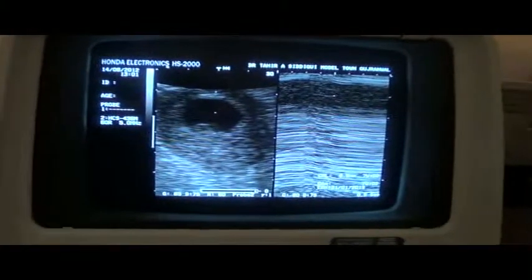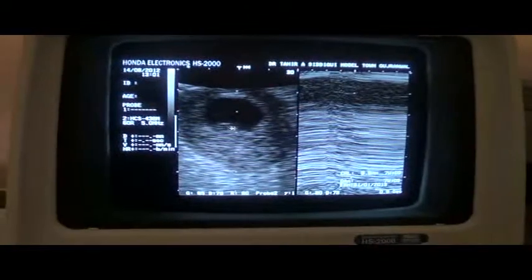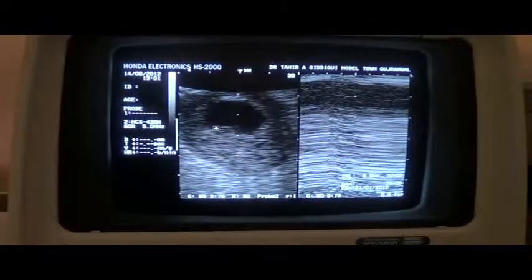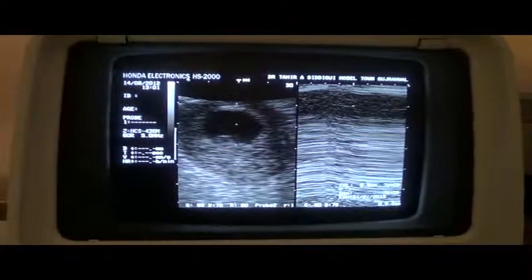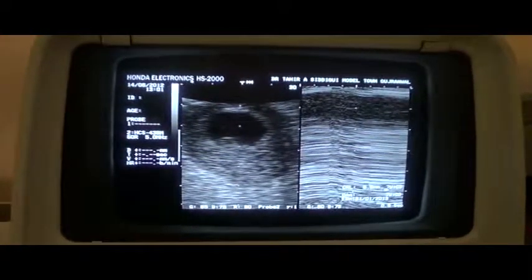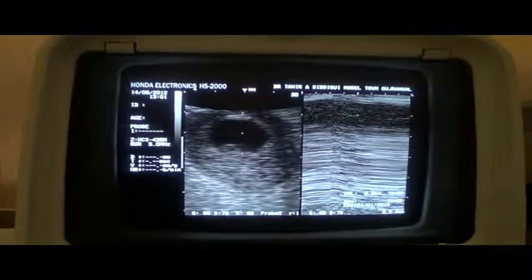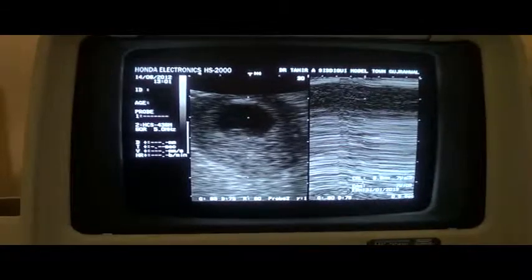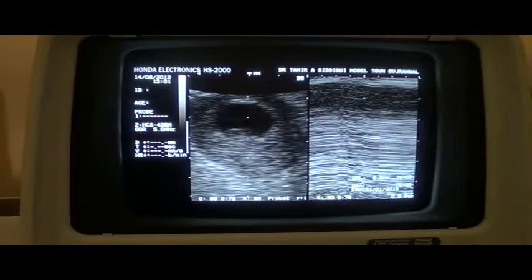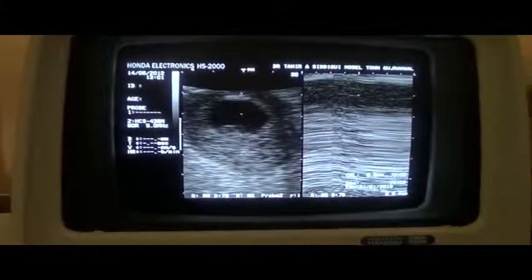This is where we left before the patient went for micturition. The fetal pole is measurable, which is important. Secondly, the crown-rump length is 9.9mm, which corresponds to a gestational age of 7 weeks. Cardiac activity is expected at 7 weeks 5 days, so she has 5 days to go for us to see cardiac activity.